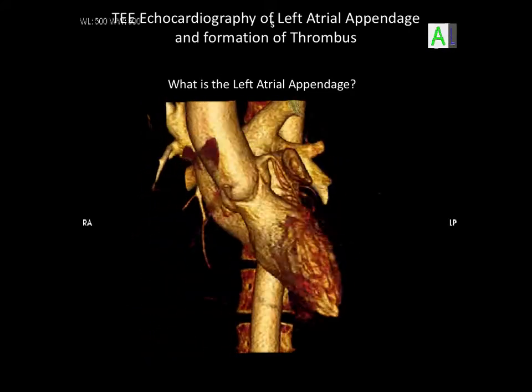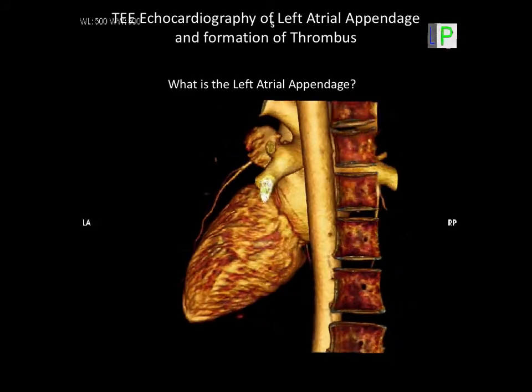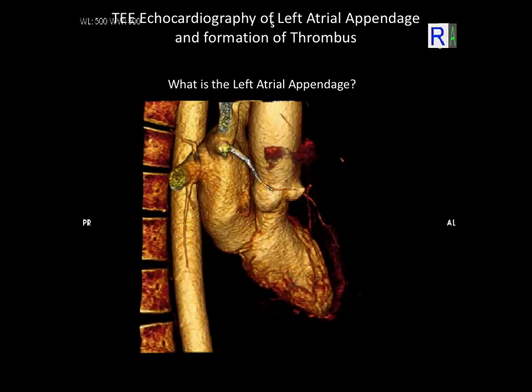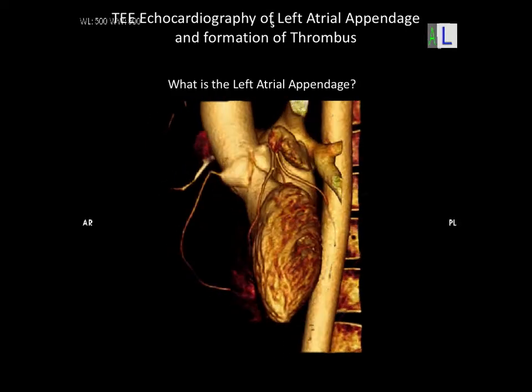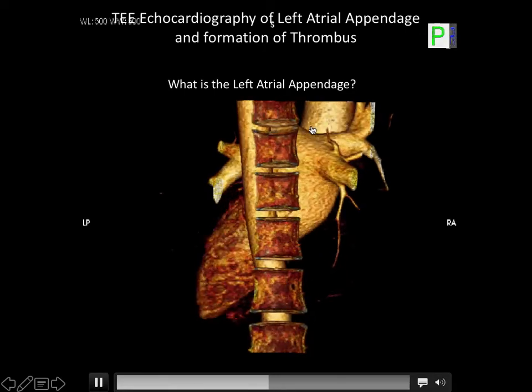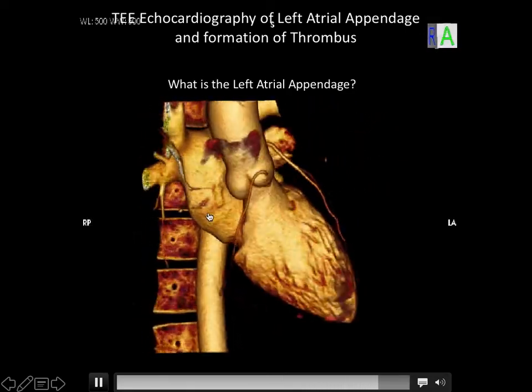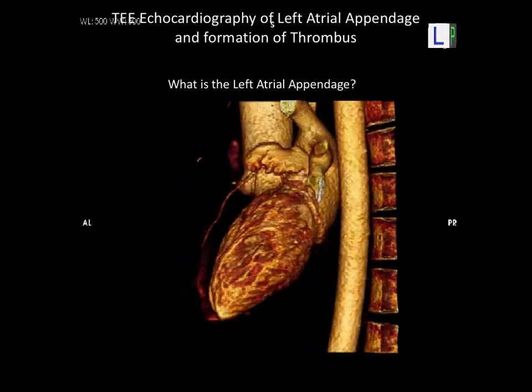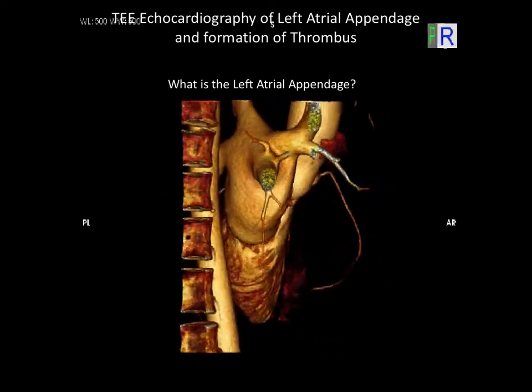What's done usually is a transesophageal echo. So you actually swallow the probe down your esophagus and they look up at your atrium, right? It's not terribly pleasant, but it's very accurate. But also you can see in this data, you see very nice depiction of the surface of the left atrium. So this signal, this gold signal here, is blood. And the reason it's very bright is because we put contrast in the blood, right? So it casts a really strong shadow on CT.